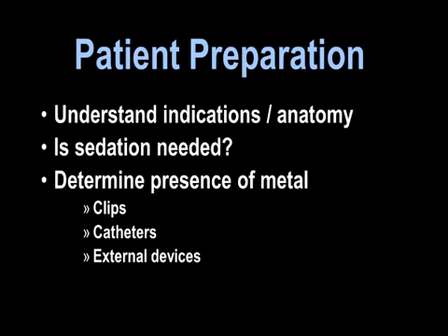Because if you've got a kid who moves and it's a low-dose examination, that's a wasted dose. It doesn't matter how low that dose was. So these are things that I think have been put on the back burner, and we need to readdress these in terms of scan quality.